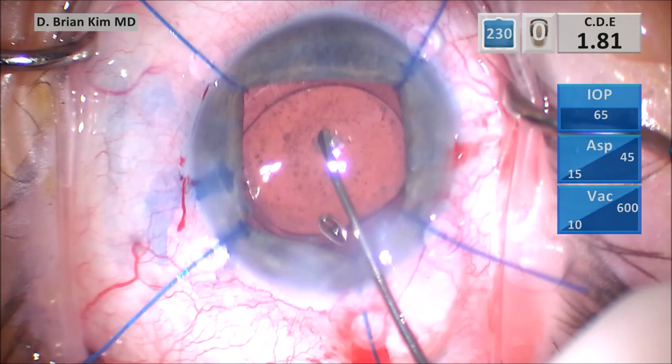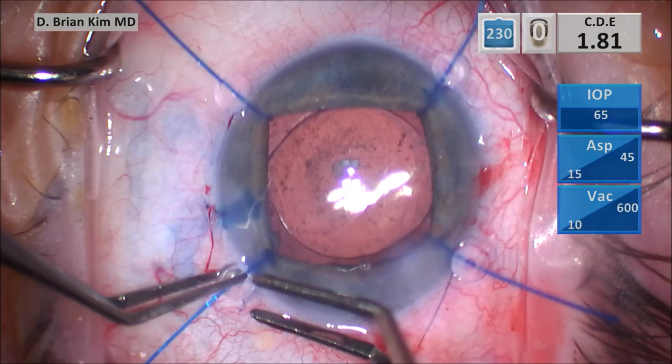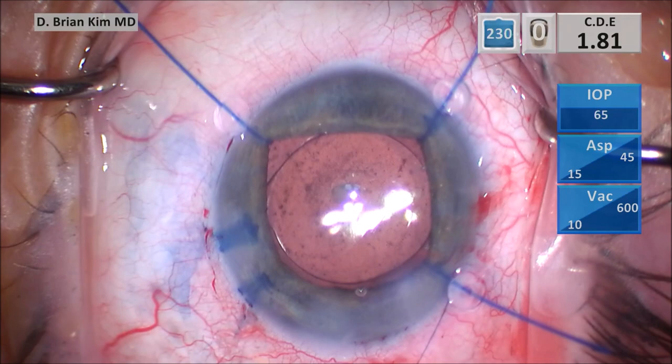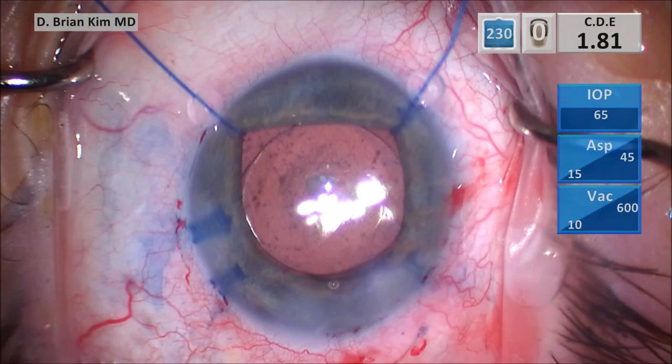I'm disengaging each iris hook: grab the stopper, grab the proximal part of the hook, pull the stopper back, twirl the hook using the stopper so it disengages the pupil, and then pull it out. Again: grasp the stopper, grasp the proximal part of the hook, pull the stopper back, twirl the hook — it disengages the pupil — and then pull it out.